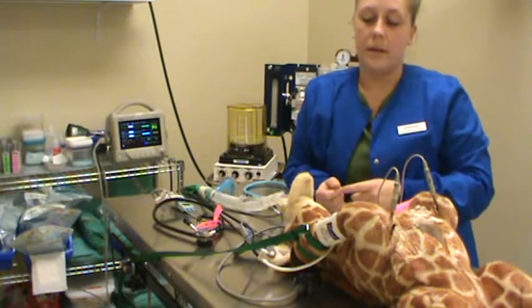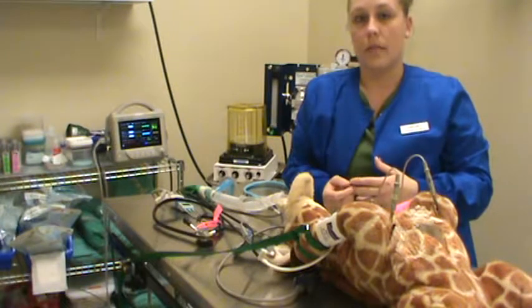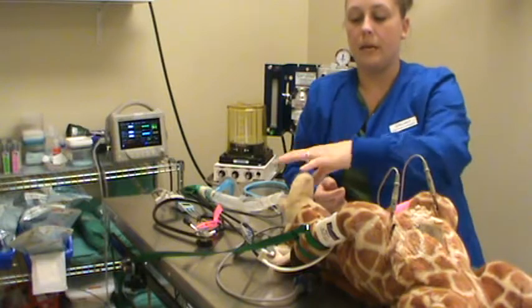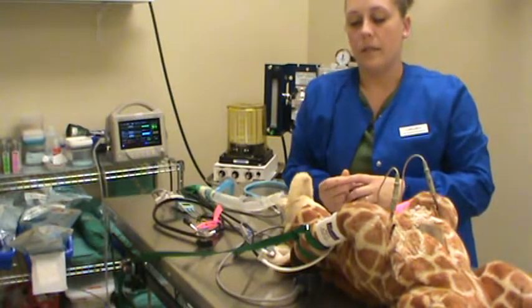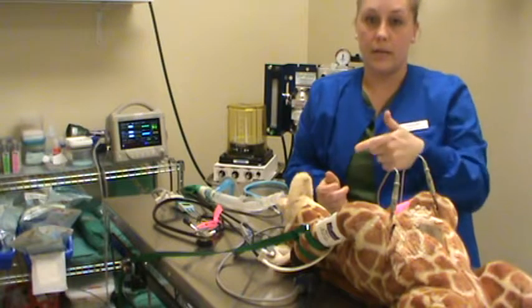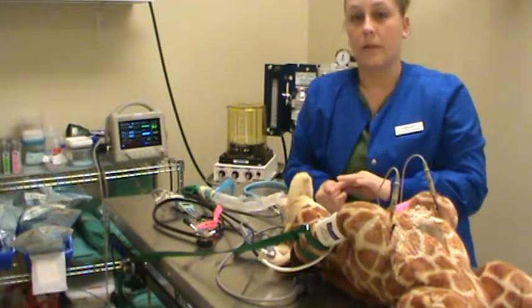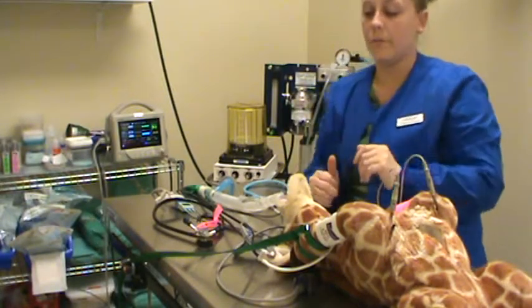Pale pink is okay, but it just means that maybe the pre-medications or the anesthetic that we gave is causing a little bit of pale mucous membrane. So we watch that closely. CRT is really important to us, so we use our eyes as well as listening to the monitors when we monitor a patient under anesthesia. So CRT and mucous membrane color.